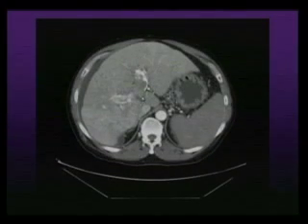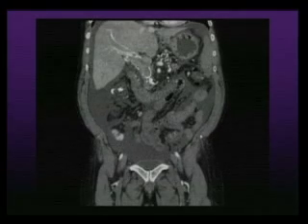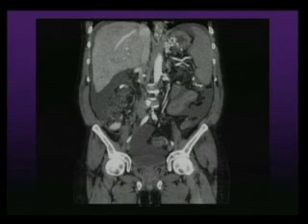This is him. On top of that, when he got CT done, he has a portal thrombus, so you can't attempt a TIPS on him. This is his spleen. You see the portal thrombus all the way here. You can see the beautiful portal thrombus. This is all portal thrombus. That's his spleen, ascites. What options do we have for him? This is an image showing all the gastric varices, and they're all coming from towards the spleen.